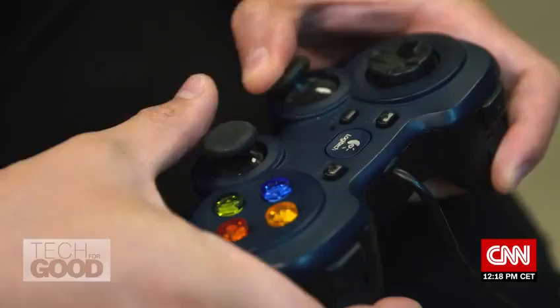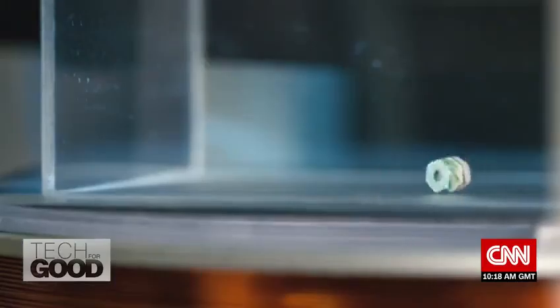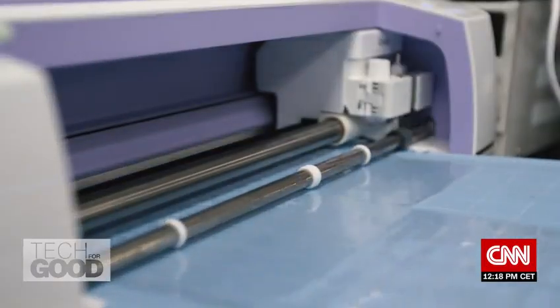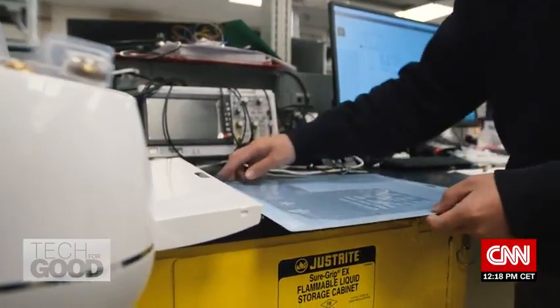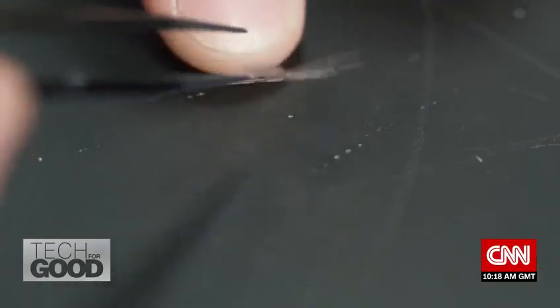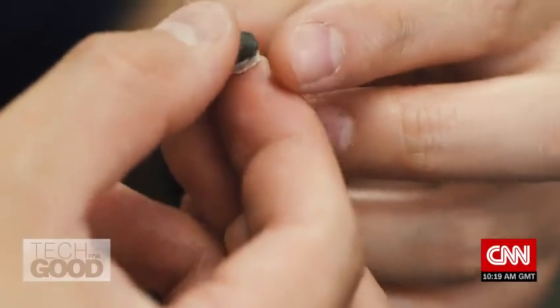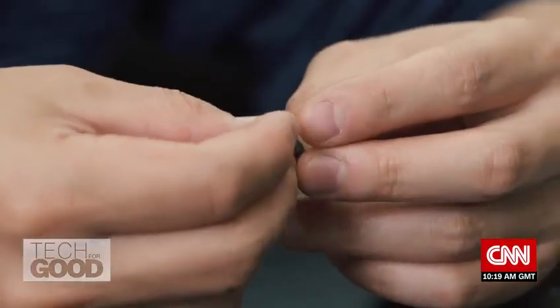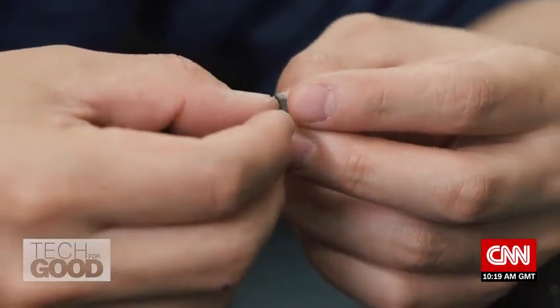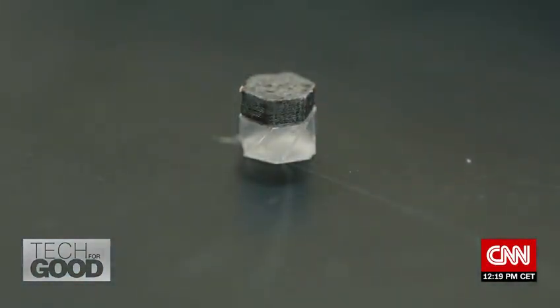Inside Zhao's lab, engineering students are working on developing a host of tiny robots that may soon reconfigure the way doctors treat patients. The process begins by printing out a plastic origami cutout and manually assembling it into a single foldable unit. After that, a 3D printer can extrude a polymer resin containing magnetic particles onto a glass plate, which gives each unit a magnetic polarity and provides the driving force for the navigation of the robot.